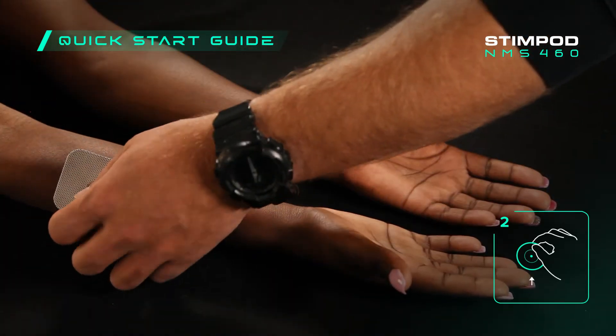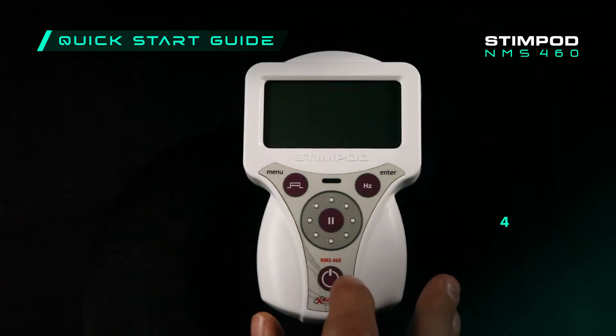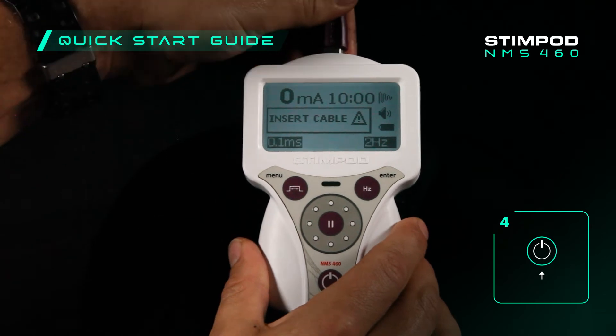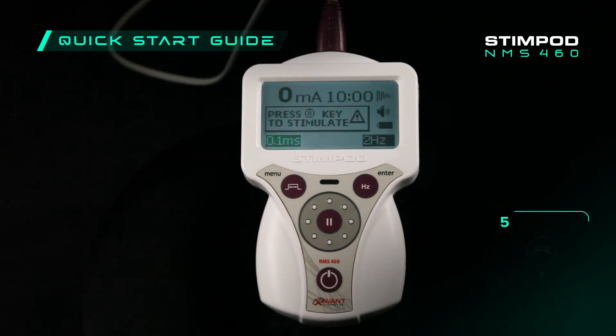Place the reference electrode on the patient contralaterally to the treatment area and connect the clip. Power on the StimPod and insert the treatment cable. Ensure the pulse width is set to 0.1 milliseconds by pressing the pulse width button.